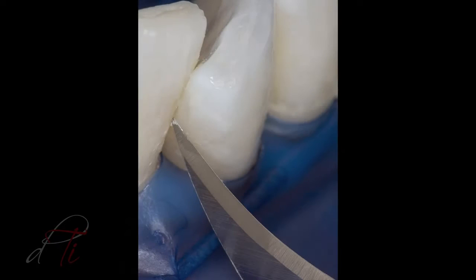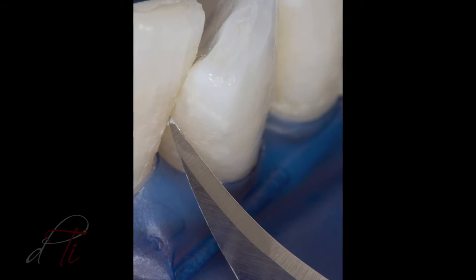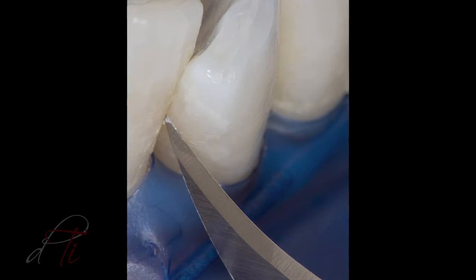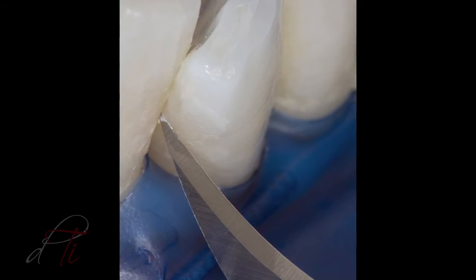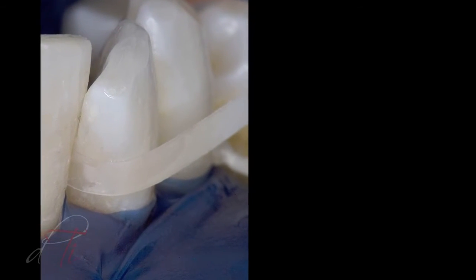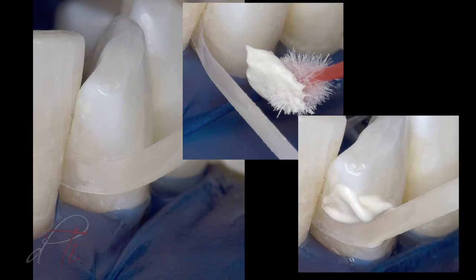The mylar strip was removed and the interproximal region was inspected for any residual composite resin tags or overhangs. The excess residual resin was removed with a surgical blade, a number 12 BD Bard Parker by BD Medical. The proximal surfaces were cleaned and smoothed with a loose abrasive diamond polishing paste carried into the interproximal region with finishing strips using the ET composite polishing system by Brassler USA.